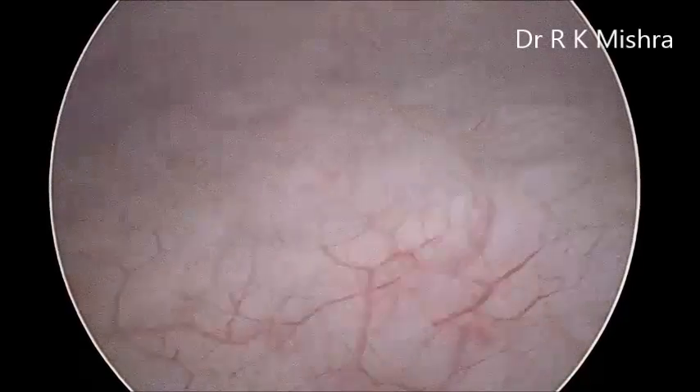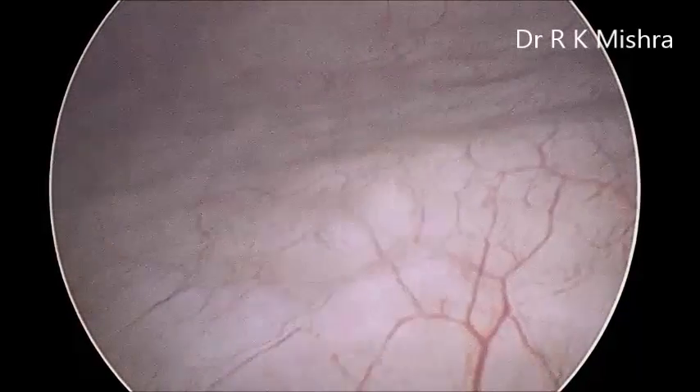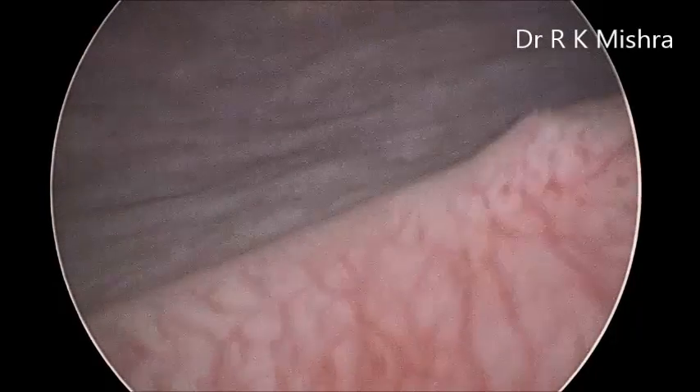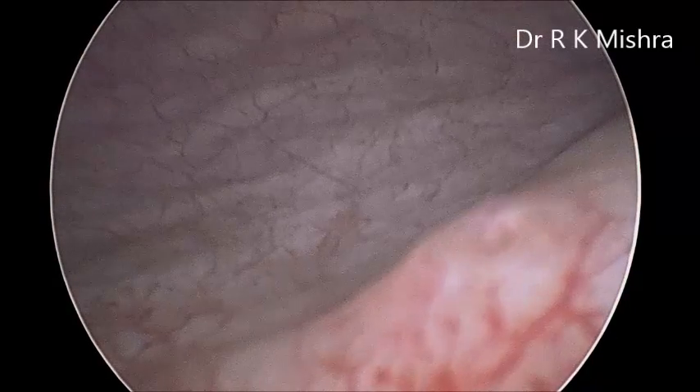This is the right side. This is the posterior wall of the bladder, which is quite normal. And now this is the left side of the ureteral opening.